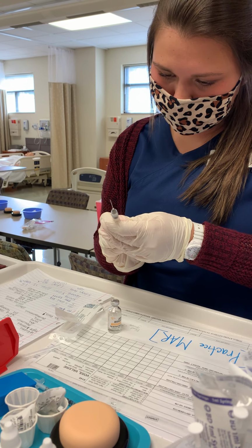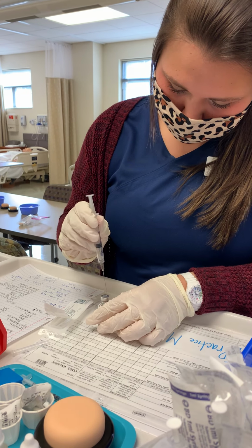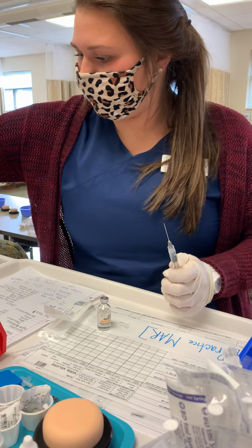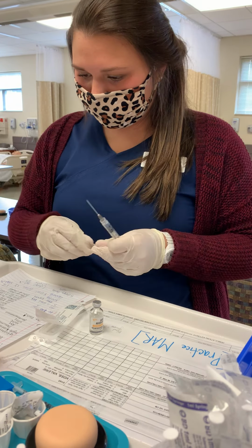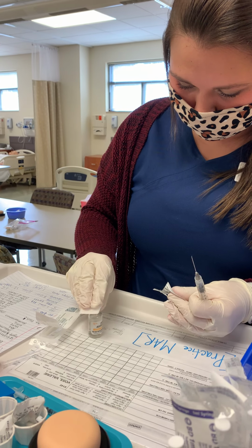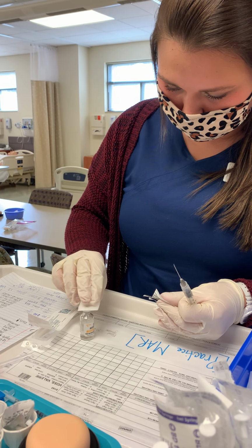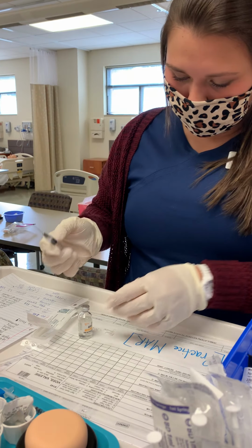Okay, I'm going to re-wipe it for 5 seconds. All right, I've got my air drawn up.